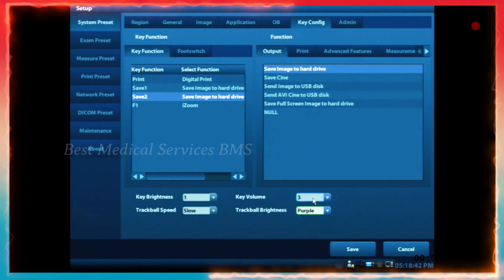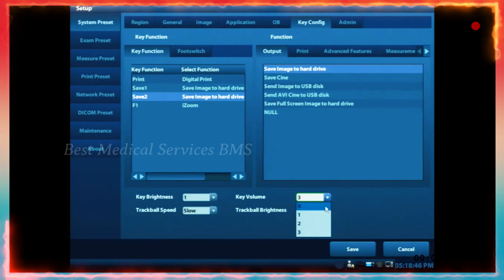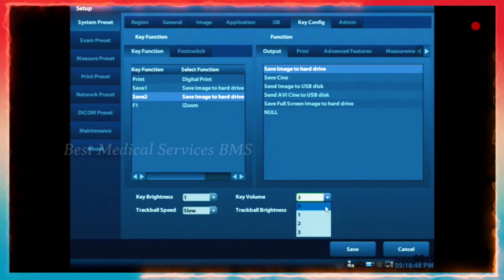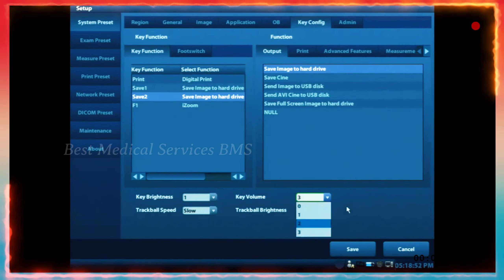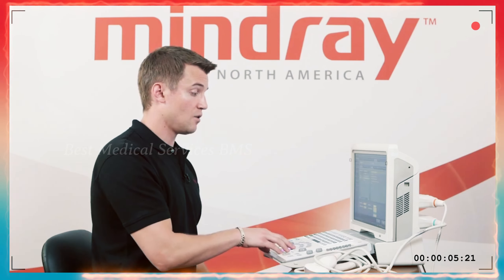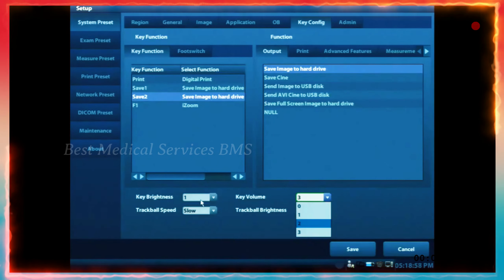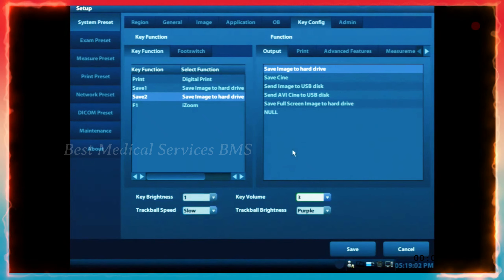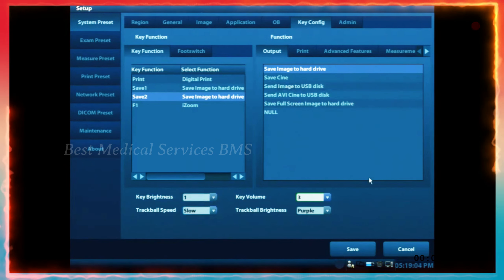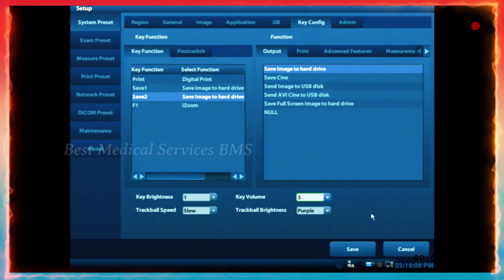You can change the key volume. If you select that, you can have it at zero for muted, or one, two, and three, depending on if you like to hear the sound of each keystroke. You can also change the key brightness as well as the trackball speed. Whatever changes you make, make sure that you click save when you're finished using the trackball and the set key. That will save any changes you've made.